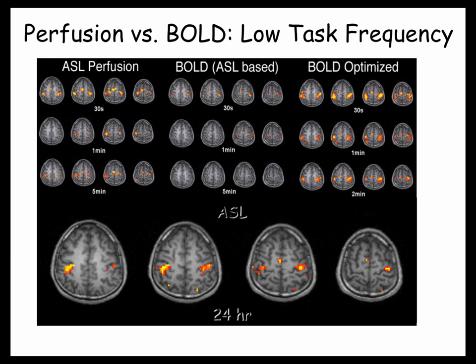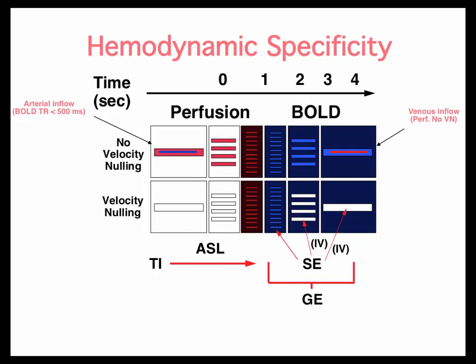So if you were doing an experiment like this, you can imagine slow brain activation with state changes, like looking at drug effects or effects with eating or things like that. You can imagine perfusion would lend itself to that. And also it might be worthwhile to look at perfusion as a sort of metric of baseline metabolic rate. Like you might be able to collect maps of perfusion of maybe people with ADHD versus maps of those who don't, and just subtract the maps to look at the areas that might have chronically elevated or decreased perfusion, as sort of a metric of what the ongoing activity is of those tissues. So I'm going to skip that.